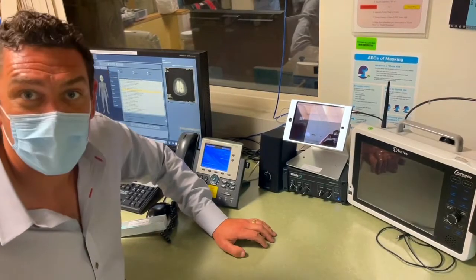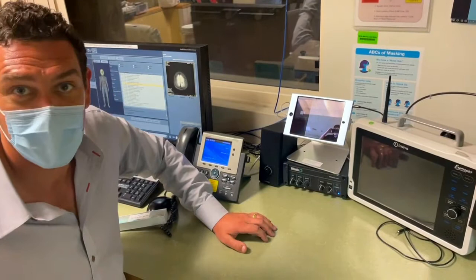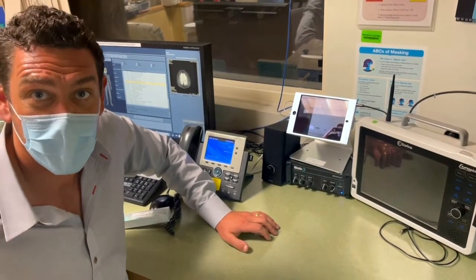I am a strong believer that a picture is worth a thousand words, and since we've installed so many of these audio systems, we know them like the back of our hand. If we can see what's going on, we can help you troubleshoot.